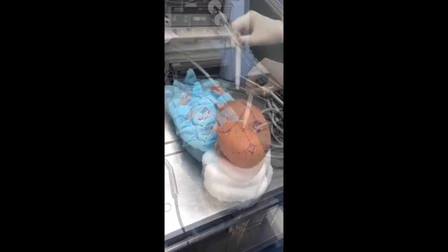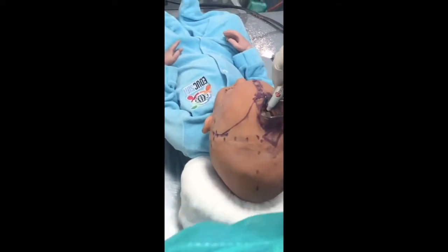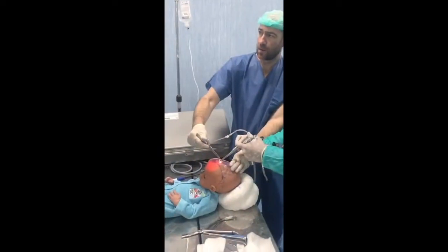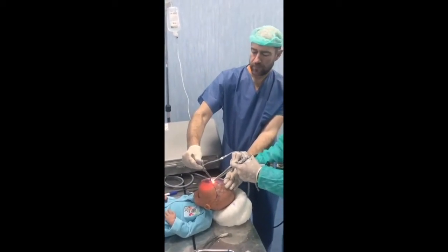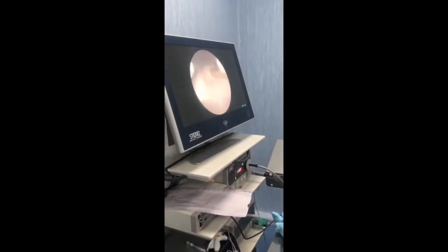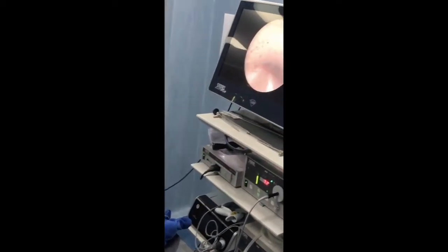Craniosynostosis is a premature fusion of cranial sutures and requires surgeries to decrease cranial pressure and remodel the affected areas. However, mastering these procedures requires years of supervised training. To shorten the training time, surgical simulation can be used. Several neurosurgical training simulators have been created to shorten the learning curve.